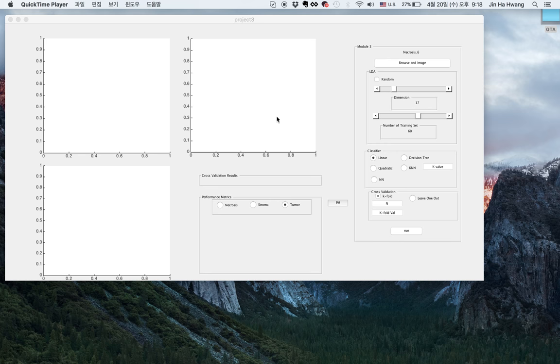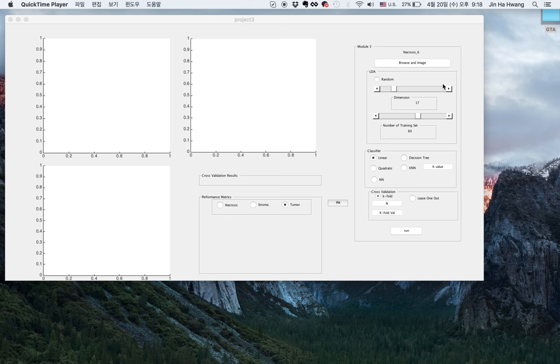Hi. This is our GUI. As you can see, we have three axes and three text labels for cross-validation performance metrics. On the right, we have our user selection.